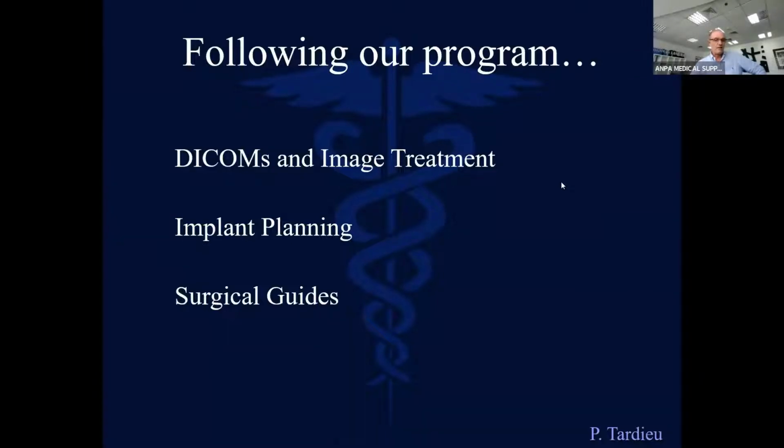And the last step, this will be my next webinar. I will talk to you about the surgical guides. I invented the first surgical guide, which was called the SAFE system, in 2000, 23 years ago. And today on the market, you have a lot of copies of that. But we started that with Materialise at that time. And since that time, there are very, very few enhancements. So I will talk to you in depth about what the surgical guide is, where we can have some mistakes based on the use of surgical guides, and how this is working. Today, let's start with implant planning.